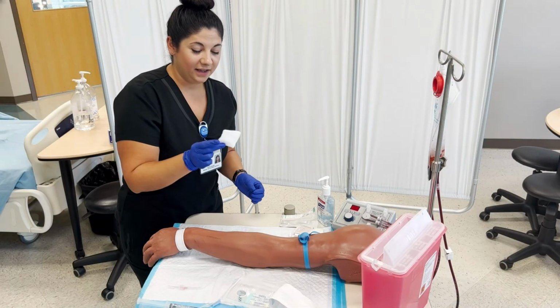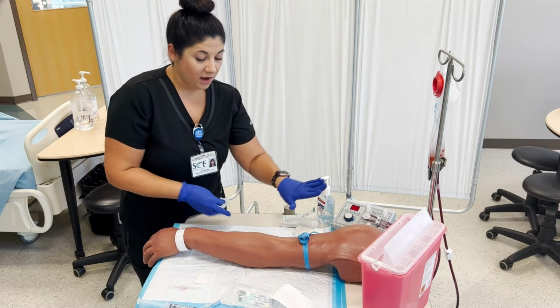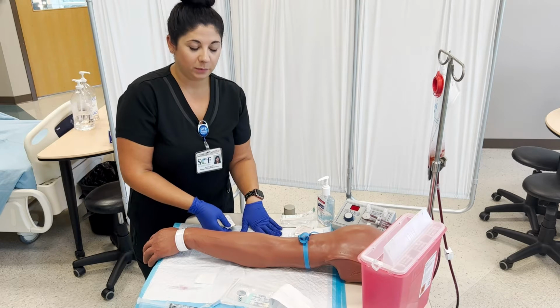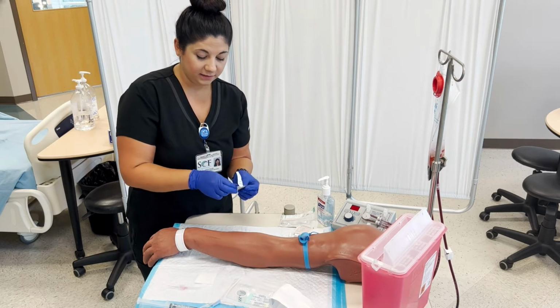I have a gauze pad ready for me. I'm going to put that right there. I also have a chucks or a towel underneath my patient because this can get a little bit messy, so you want to have something that is easy to take off.